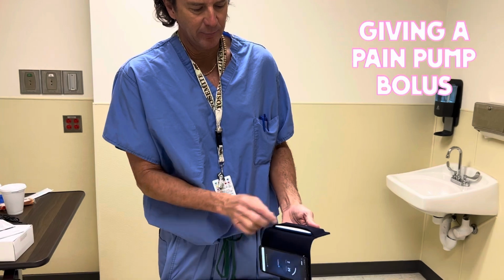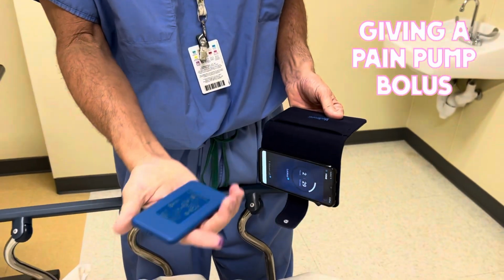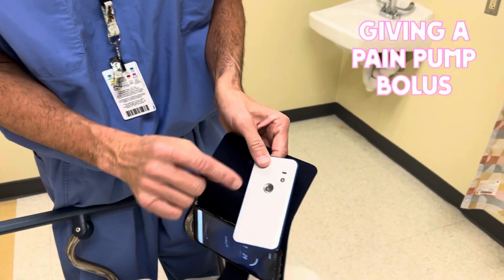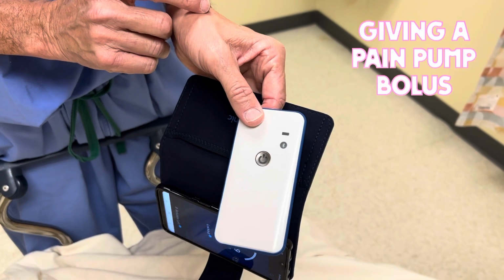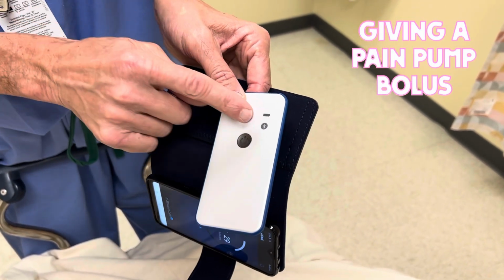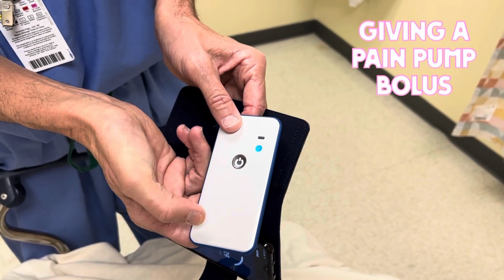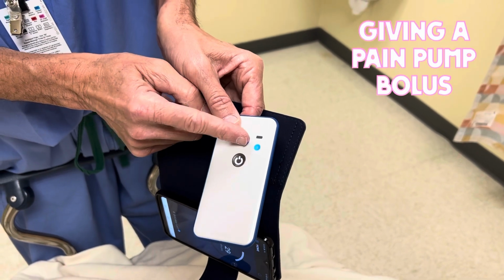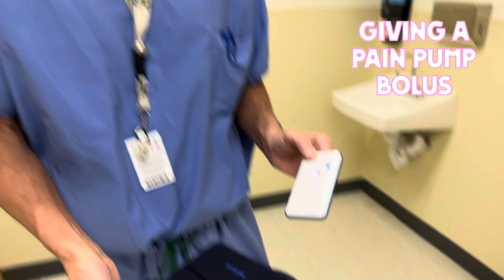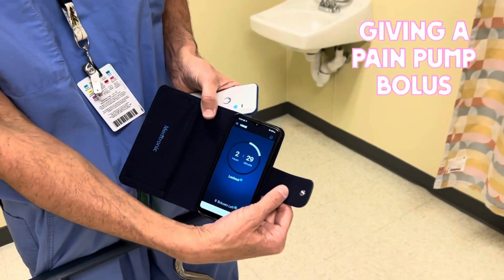On the other side of the packet is the connector. It's a little thing about the size of your palm. One side is blue, one side is white. There is a button right on the back of it. When we depress the button, this little light will light up, and this shows us that the Bluetooth is active. So if we hold this down and that comes on, this lights up, this blinks, and this connects with the phone.